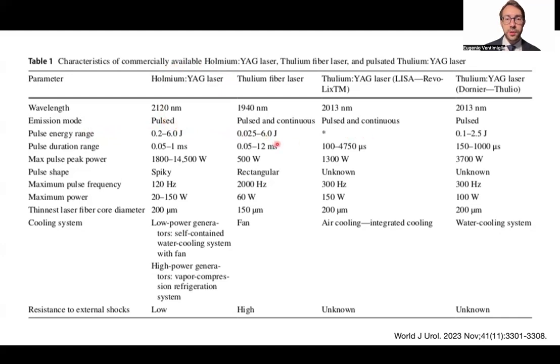We have different ranges of pulse energies, but what I want you to focus on is that different lasers have different peak power values. We've seen before, and I want to stress this concept, that higher peak power will imply more explosive delivery of energy to the tissue, less coagulation, and better incision depth and better dissection of the tissue.